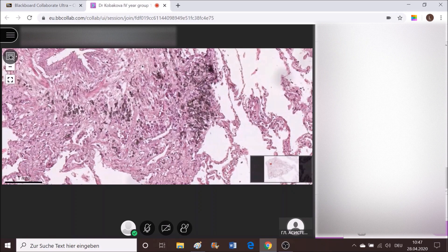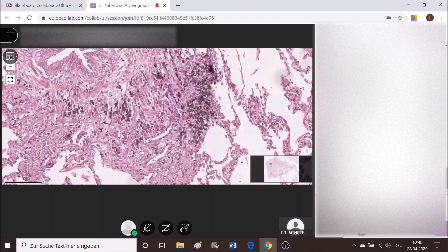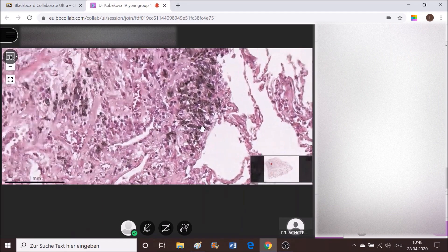Hemosiderin should be found next to erythrocytes when they're filling the alveolar spaces. It's not anthrax — anthrax, as I repeat over and over again, is an infectious disease having three forms, spread through spores. It has nothing to do with anthracotic pigment, which is carbon particles floating in the air and inhaled by people who accumulate them in the bronchial wall. They appear blackish — the only thing blacker than this pigment is melanin.